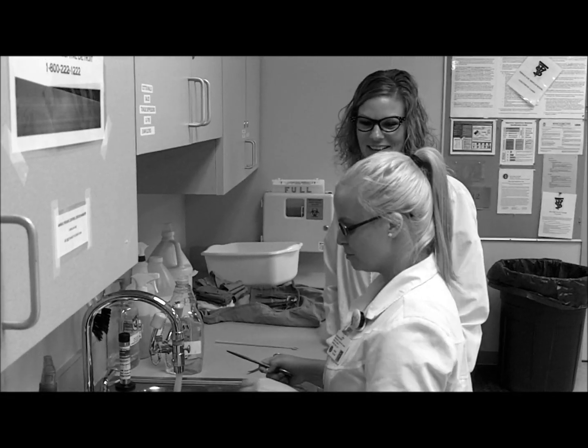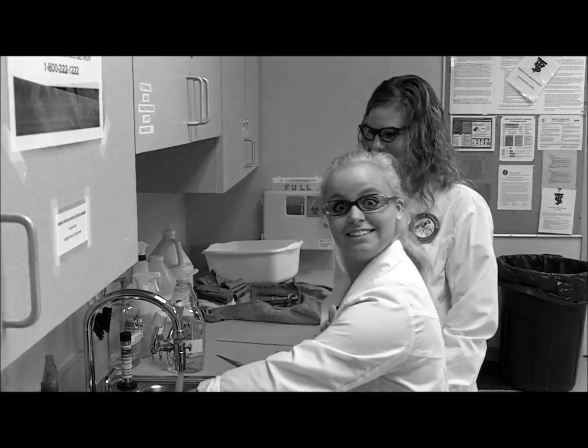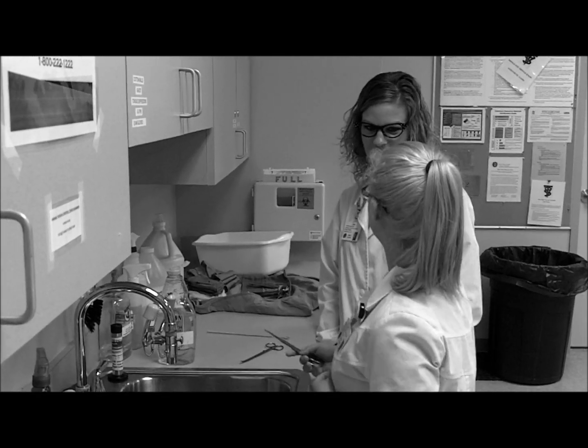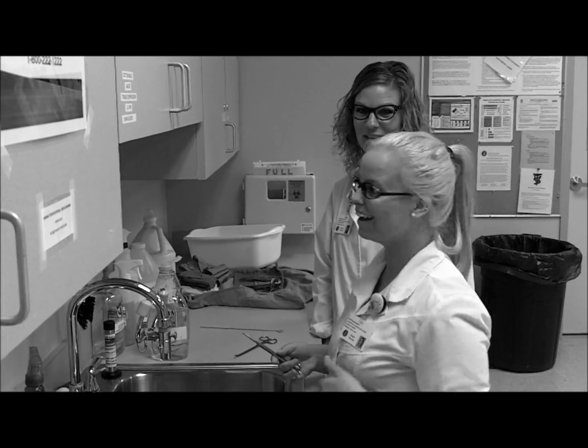What are you doing, Cheyenne? Just washing some instruments. That's not the right way to wash the instruments. Well, golly, if you could show me the correct way, that'd just be swell. I can do that.